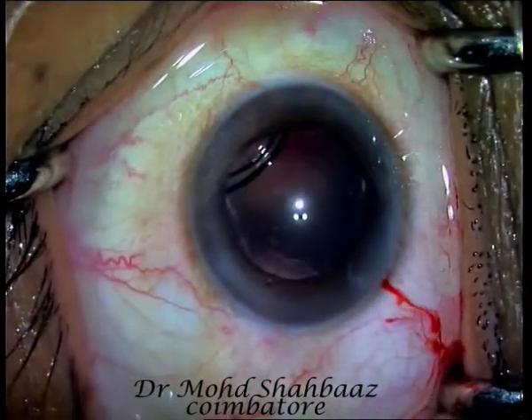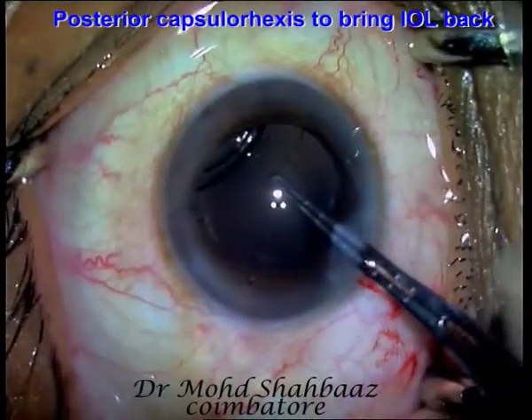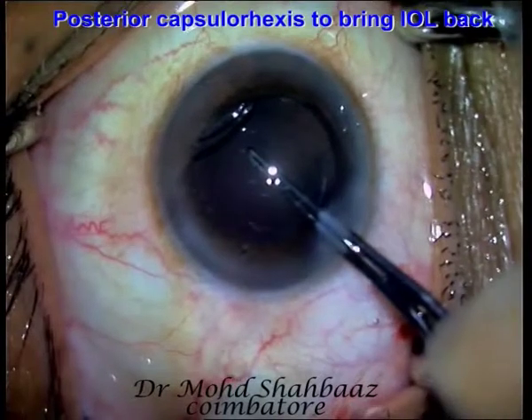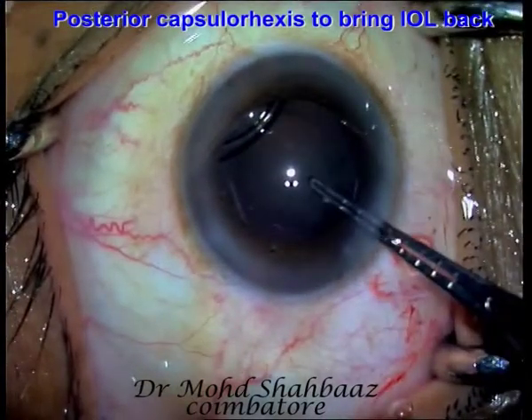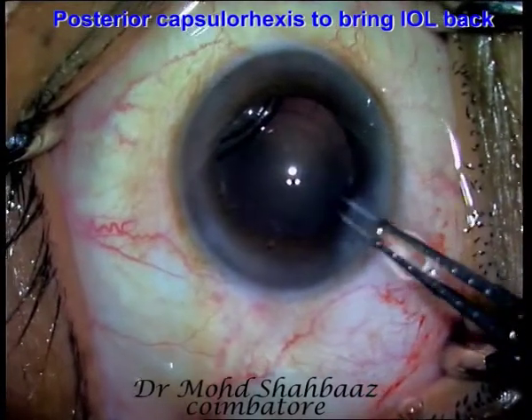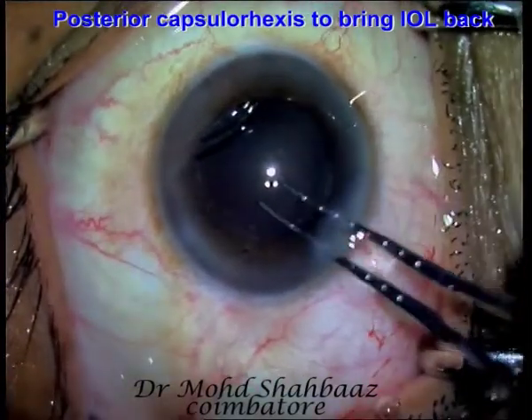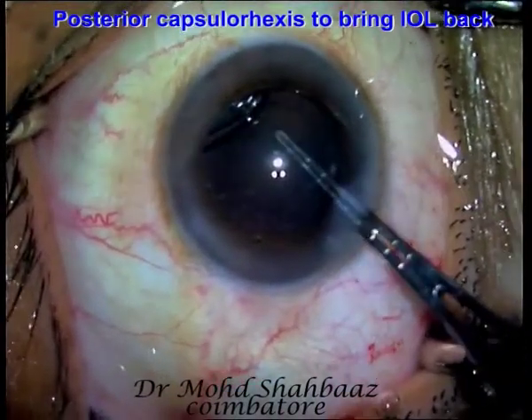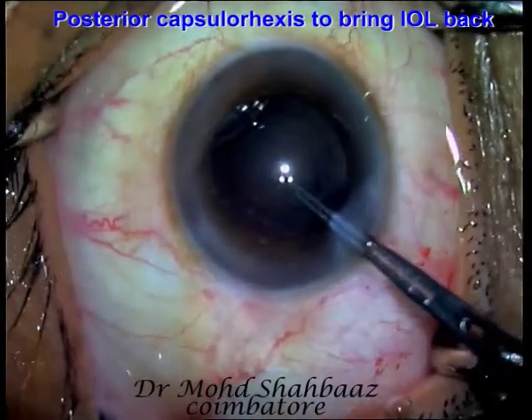So immediately I planned to do a posterior rhexis and to retrieve the lens from this. So I am using a Utrata forceps to do a posterior capsulorhexis, holding the rhexis, again leaving it and again holding it, pushing viscoelastic in between to push the vitreous back. Slowly I have completed the posterior capsulorhexis.